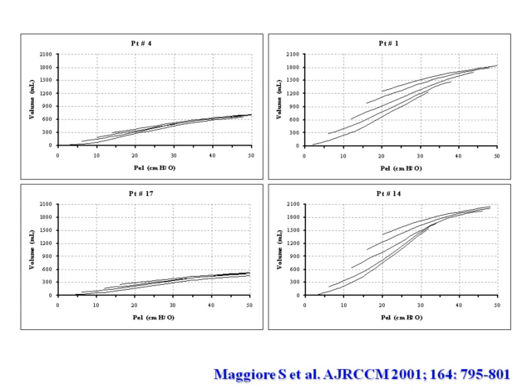Probably this patient needs much more PEEP compared with that patient here, because probably the compliance here is higher compared with that patient. If we apply 20 of PEEP here, probably we will get an enormous plateau pressure.